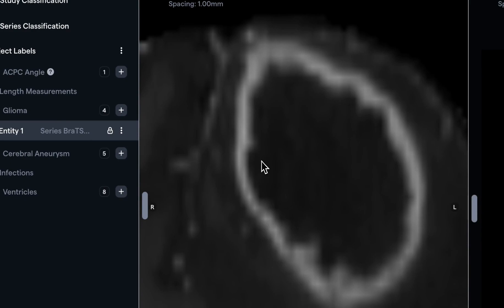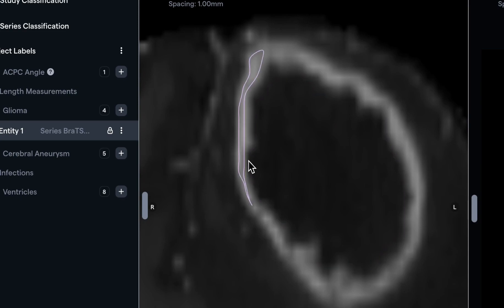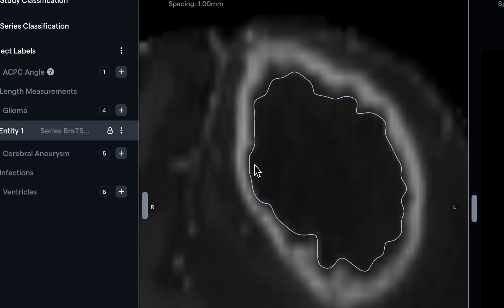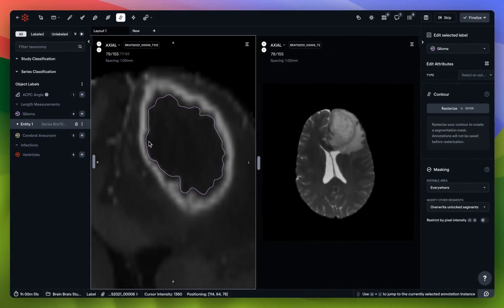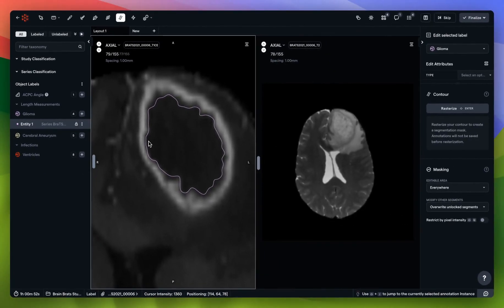The smart contour feature will do its best to detect a contour by itself without your help. All I need to do is hold in ctrl and option or alt if you're on a Windows machine, and you'll see that the contour tool is doing its best to find a contour all on its own. Let's assume that I'm happy with this contour.